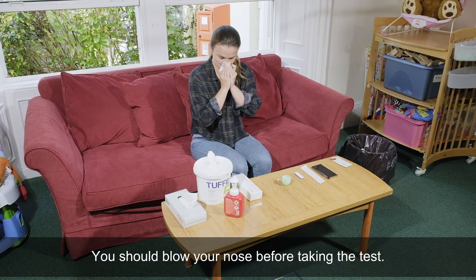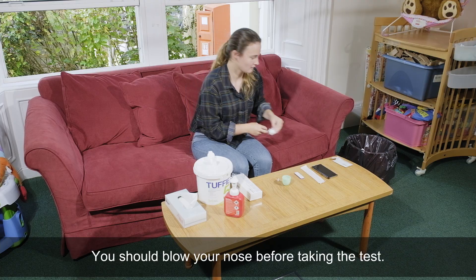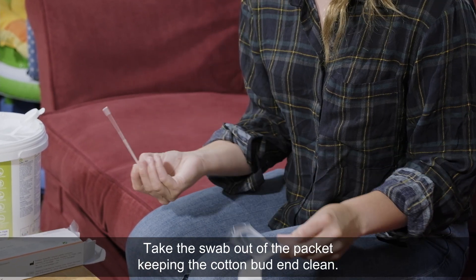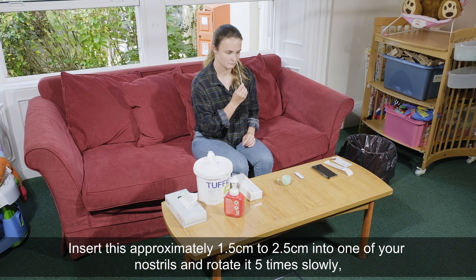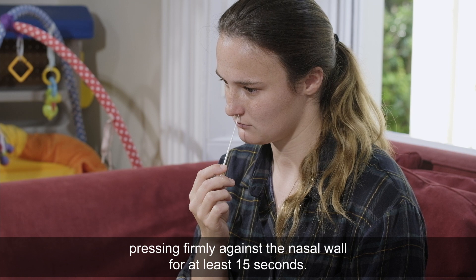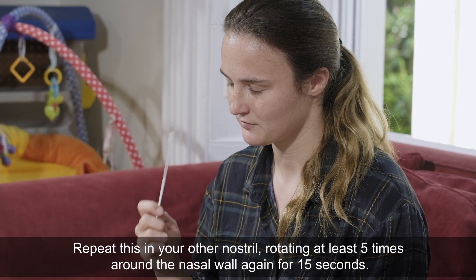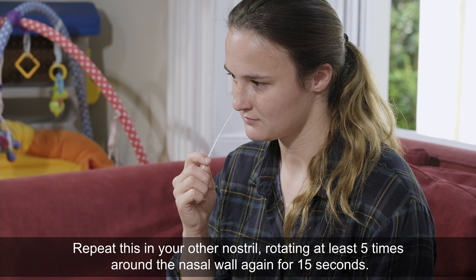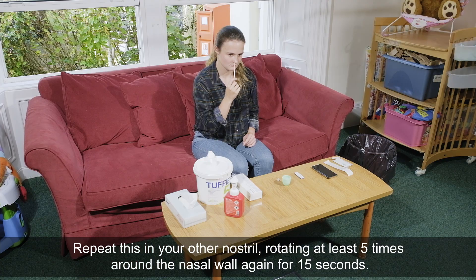You should blow your nose before taking the test. Take the swab out of the packet, keeping the cotton bud end clean. Insert this approximately 1.5 to 2.5 centimetres into one of your nostrils and rotate it five times slowly, pressing firmly against the nasal wall for at least 15 seconds. Repeat this in your other nostril, rotating at least five times around the nasal wall again for 15 seconds.